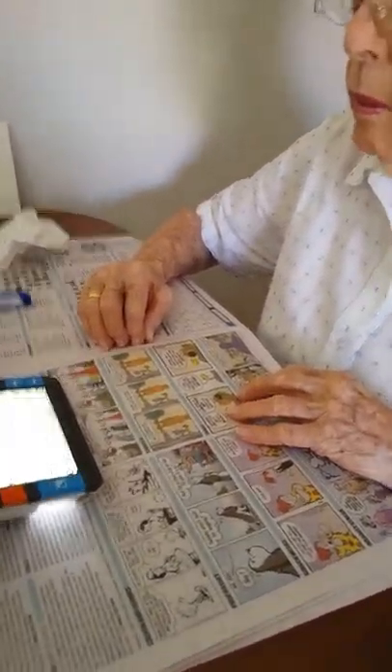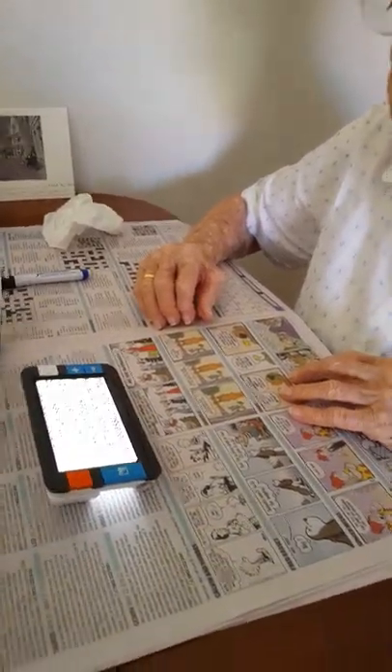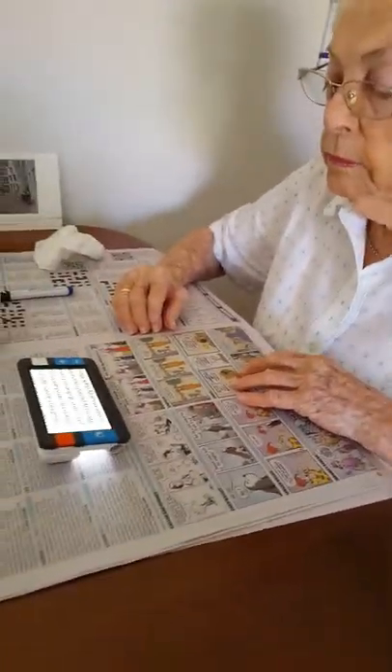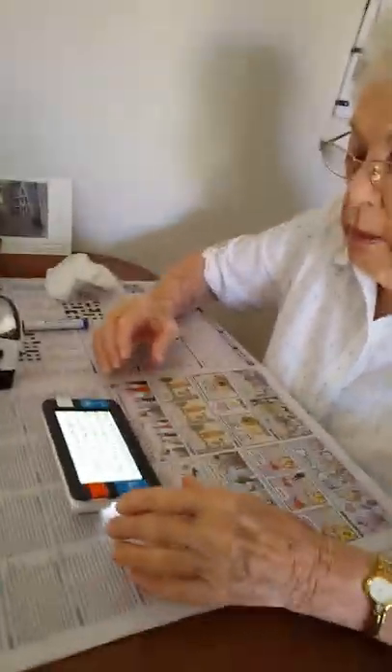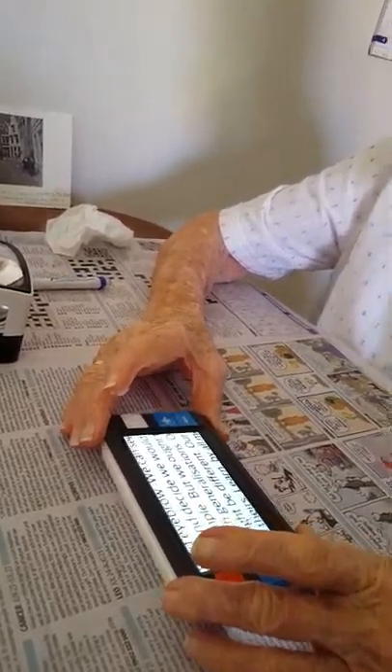But what you have had some success with is the Compact Plus. And what I'd like you to do is just read for me out loud just one of these paragraphs here, so we can just check your reading speed. Just move it over to the beginning of the paragraph — any paragraph will do.